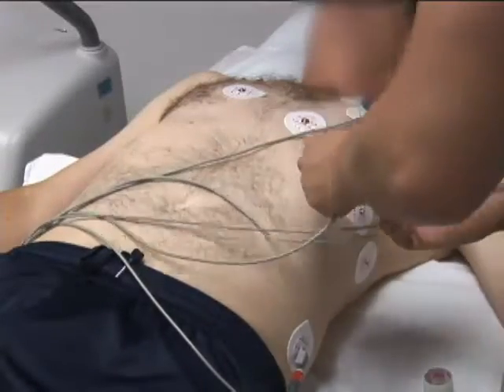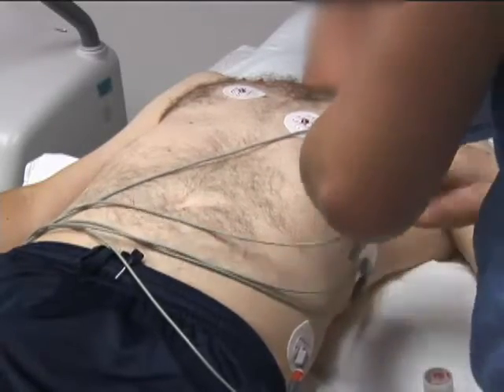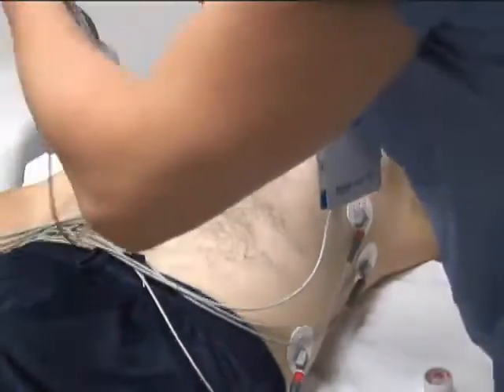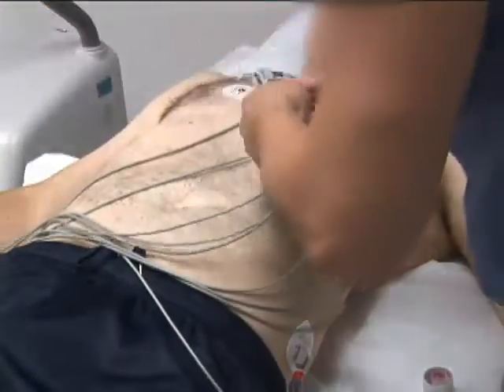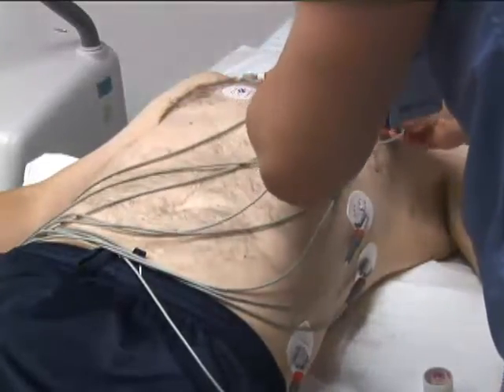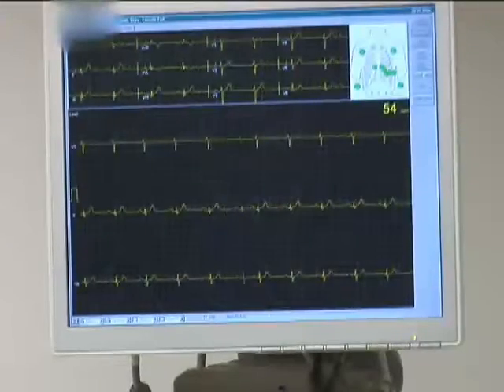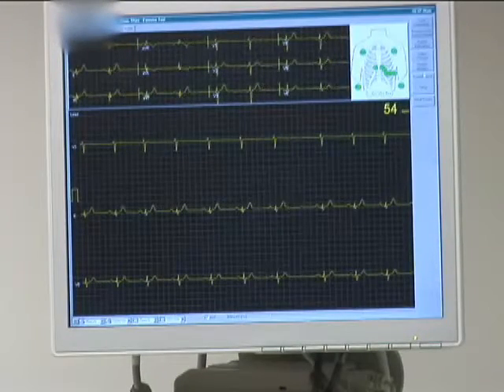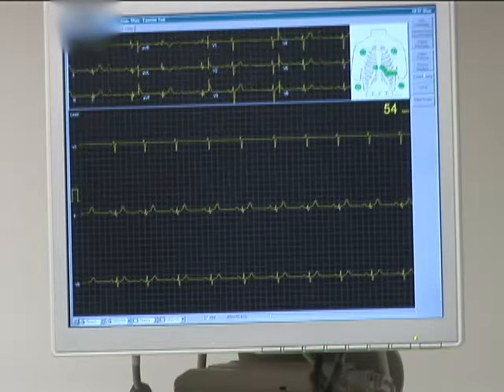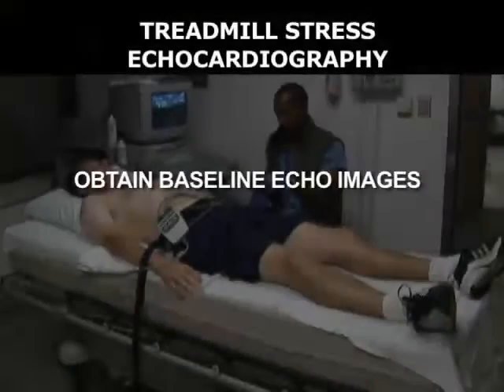The patient is set up for monitoring. The physician or nurse supervising the procedure places ECG leads on the patient. Skin preparation with alcohol and gel improves lead contact, ensuring that leads will not dislodge during the study. The MD or RN reviews the baseline ECG for baseline abnormalities. Care should be taken to ensure a tracing from all leads with minimal artifact.